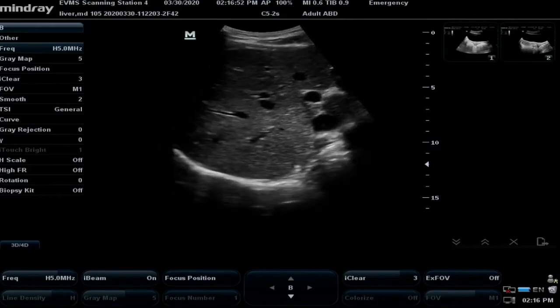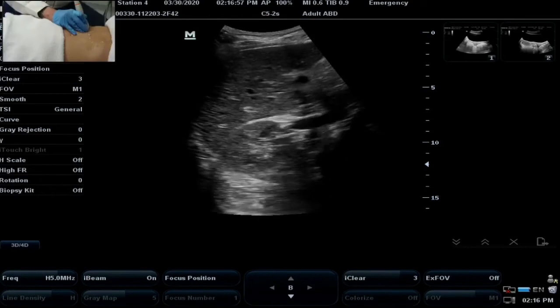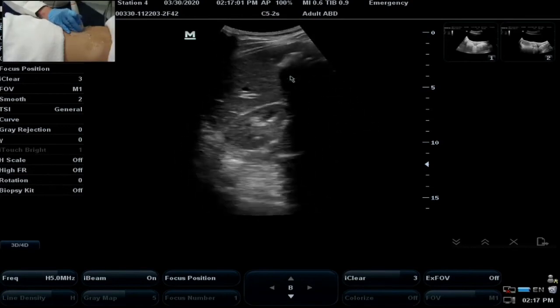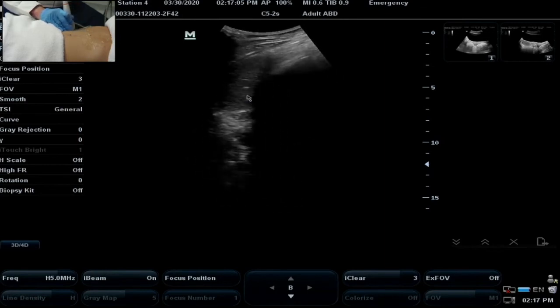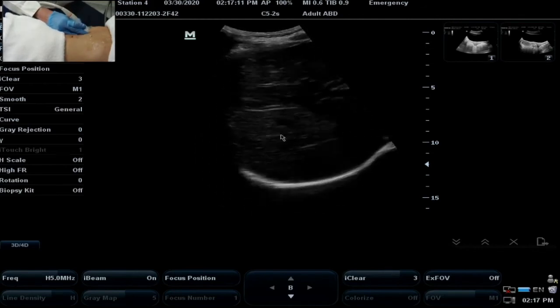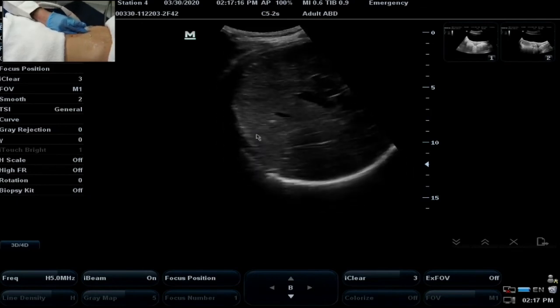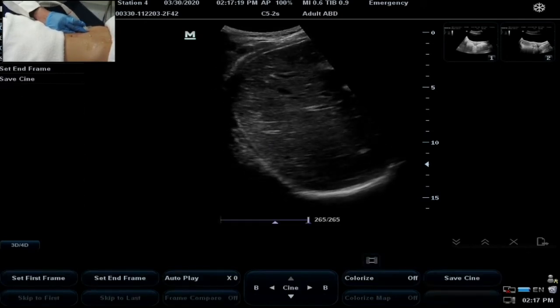Thank you. And now I'm going to continue to slide along the costal margin from right portal vein. The next thing I'm going to get to is going to be gallbladder. Here's right kidney. Still this long right lobe of the liver. And then I'm going to look up in the dome subphrenically to make sure I've evaluated for any potential masses or fluid. Breathe. Thank you.